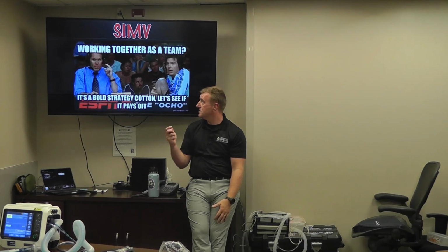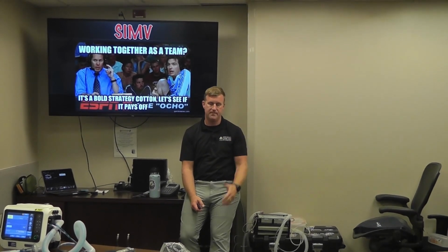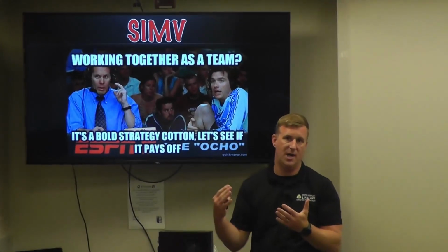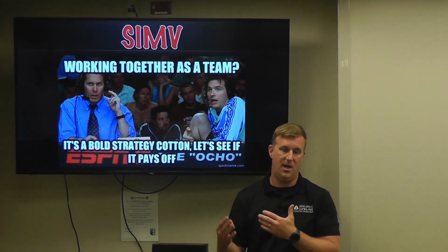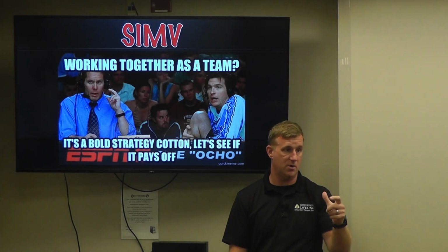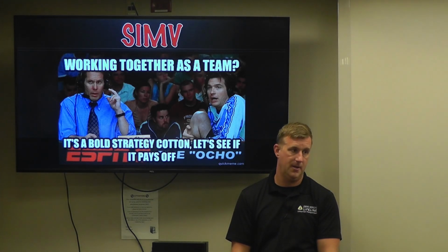Where SIMV differs is we're going to try and work together. SIMV stands for synchronized intermittent mechanical ventilation, or mandatory ventilation, depending on the book you read. Really, what that comes down to is the ventilator is going to try and work with the patient to achieve the minimum number of breaths that you've told it needs to achieve, and then it's going to support the breaths beyond that. The breath support is essentially the BiPAP you guys were on at the beginning of this class. So it's that pressure support. When the vent feels like you triggered a breath, it's going to give an additional pressure, just like you guys felt with BiPAP. So it's essentially BiPAP plus a guaranteed rate. We'll look at it here in a second.